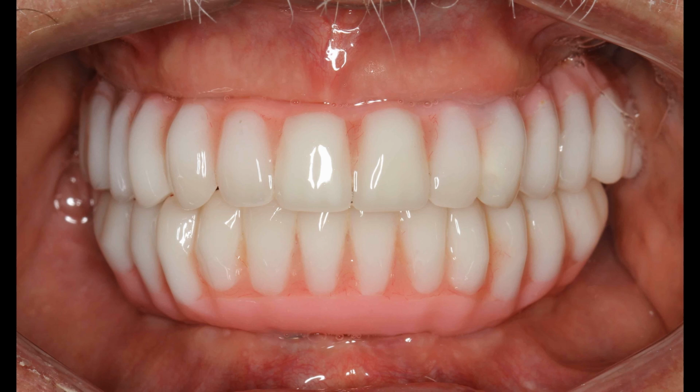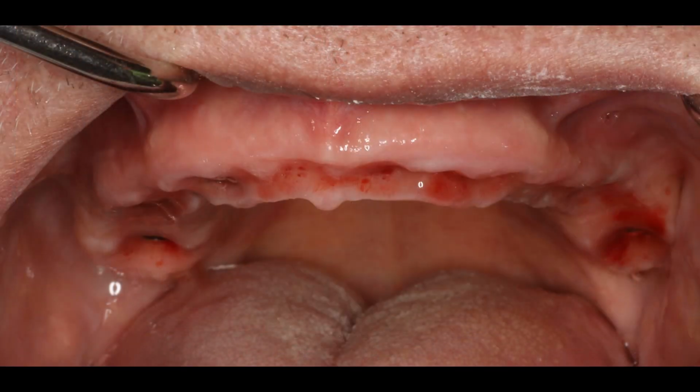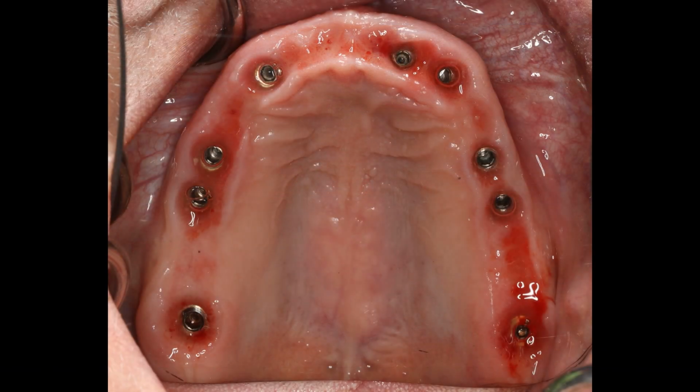But look at the tissue development that we had from a person with no teeth at all. Now we've got probably 30 to 40% of a papilla between the teeth. And that comes back to the second surgery, how I do the second surgery. So look at that. I mean, that is just a beautiful thing to behold. Taking a person from no teeth to implants and being able to have that kind of connective tissue response.